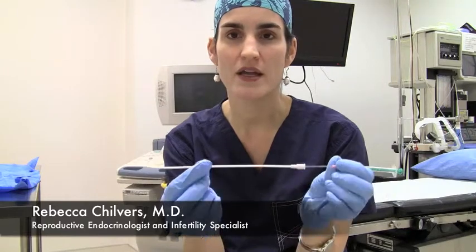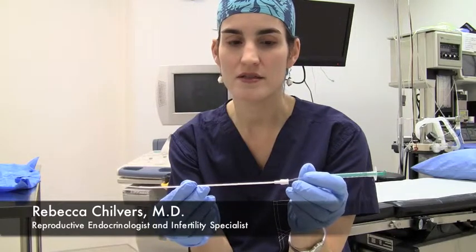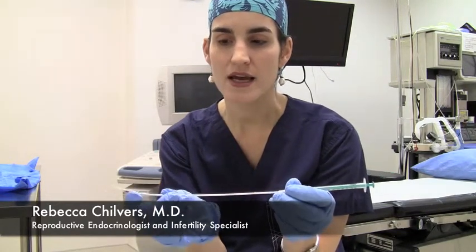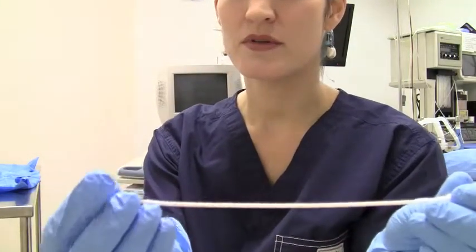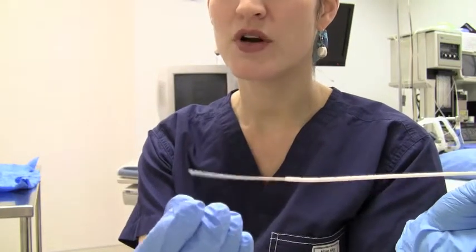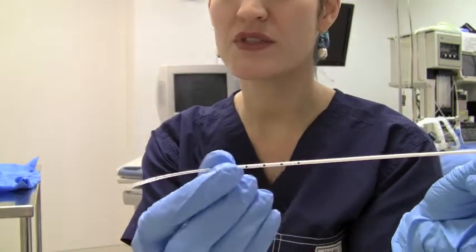As you see here, we have an outer sheath as well as an inner transfer catheter. The outer sheath is first placed through the cervix and into the uterus. The inner catheter is subsequently placed. This catheter is specialized in that it is very flexible. Because it is soft and flexible, there is minimal trauma to the lining of the uterus, and this results in improved success rates.